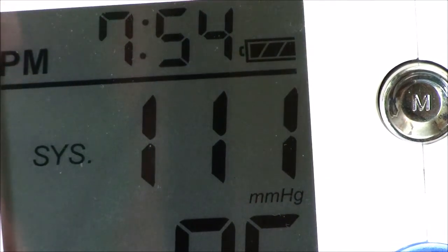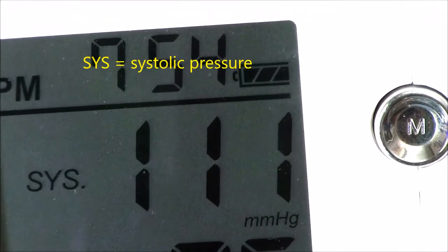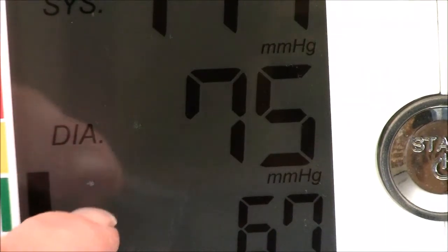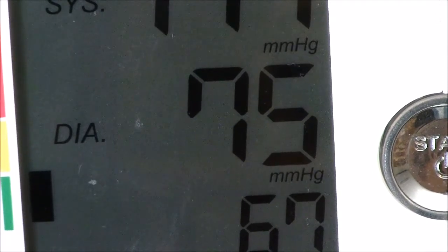The systolic is the pressure when the heart contracts. You can see it's 111 millimeters of mercury. The diastolic is the pressure when the heart is relaxed. That's 75 millimeters of mercury. So blood pressures are typically measured with millimeters of mercury.